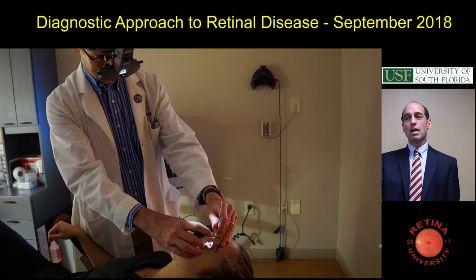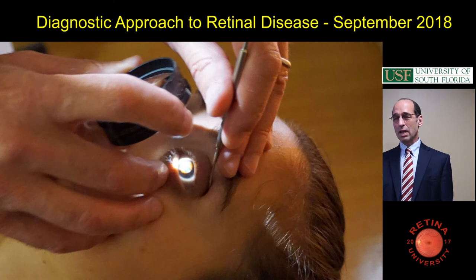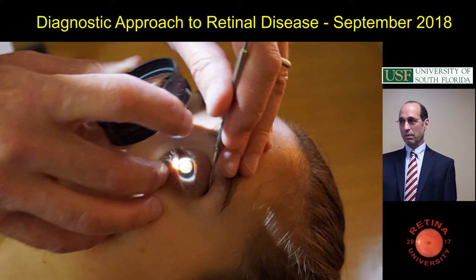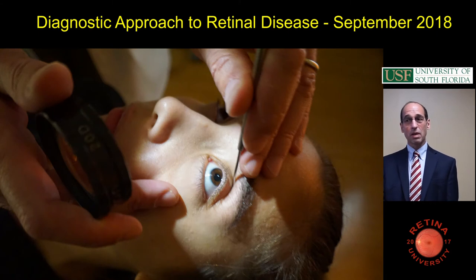Then I always warn the patient it's kind of unpleasant. I say, this is a little bit unpleasant. Then I tuck it in, and I don't push into the eye, I push back toward the orbit. So I'm not pushing on the eye directly, I'm sliding it back a little bit and then nudging in. I use a depressor, I don't use a Q-tip. Some people think a Q-tip is better, some people think a depressor is better.